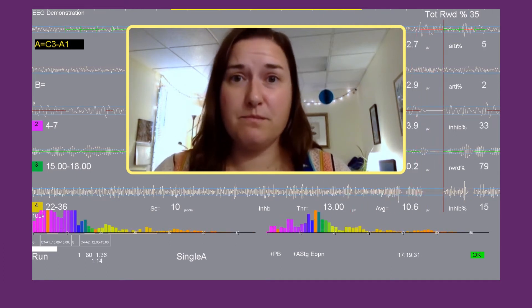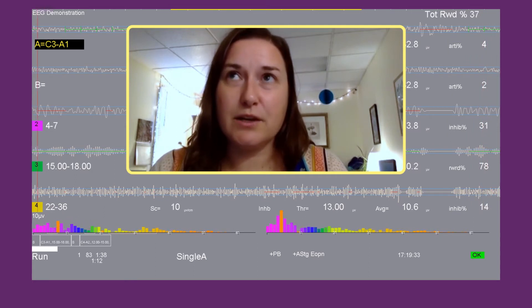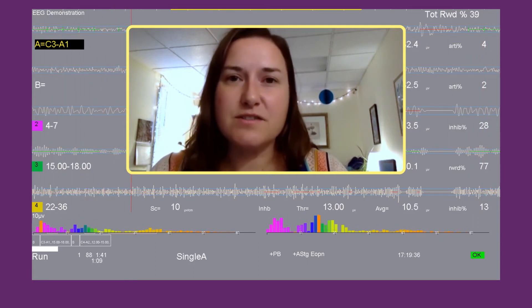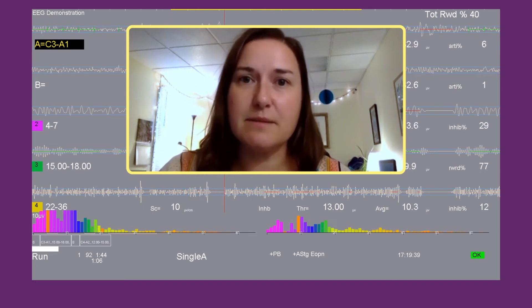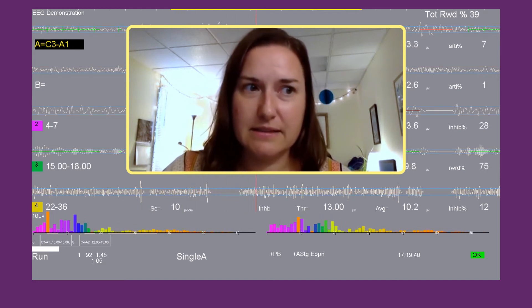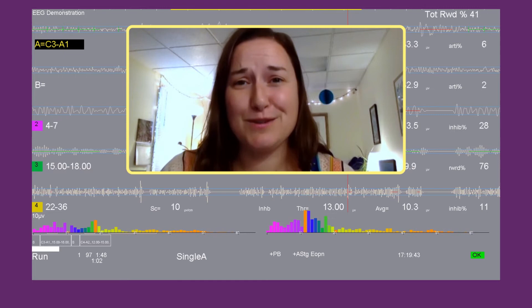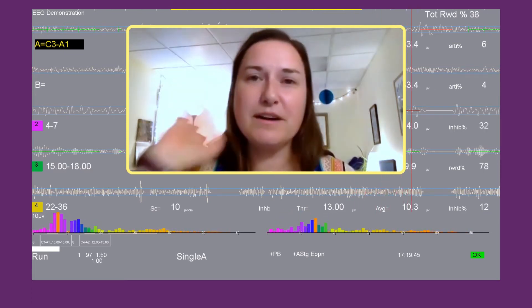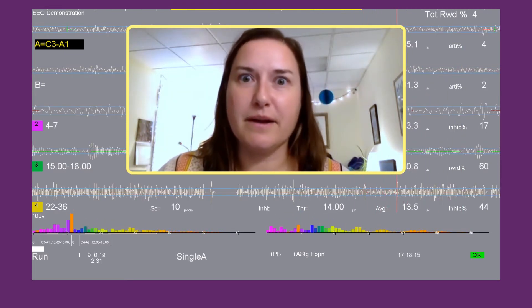Likewise, you can adjust the reward band to include the weakest frequency, especially if there's a deficit in a specific frequency band that's likely hindering the person's function. We might want to help them make a little bit more of that to help them function better.